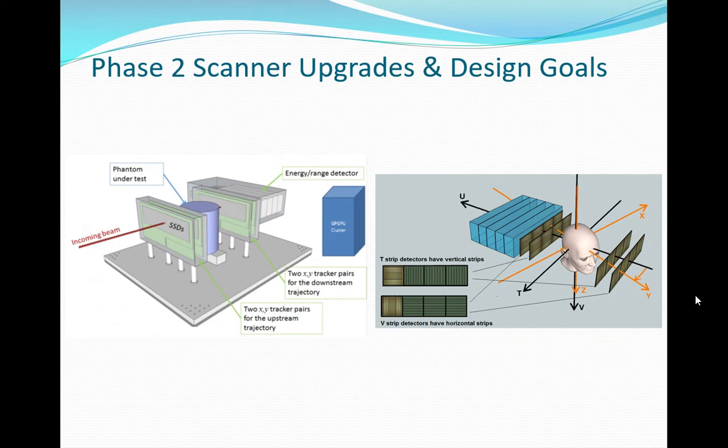The light is going to be regional, so you track them over time. I know there was light here, I know its drop off, I know when the peak was, and I can subtract that because I know the shape of the light curve. Okay. So that's my plan. Right now, that is not done. But that is actually my plan.